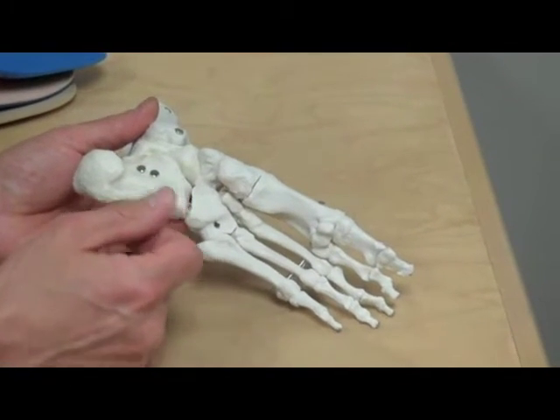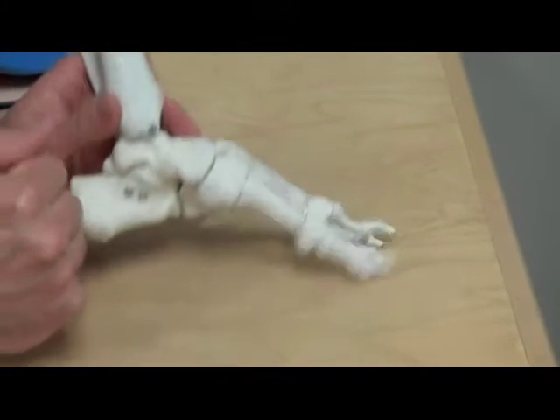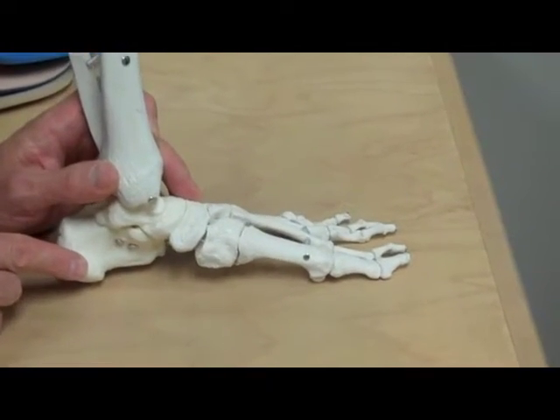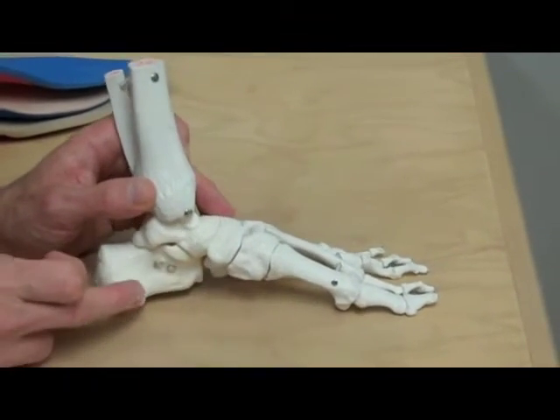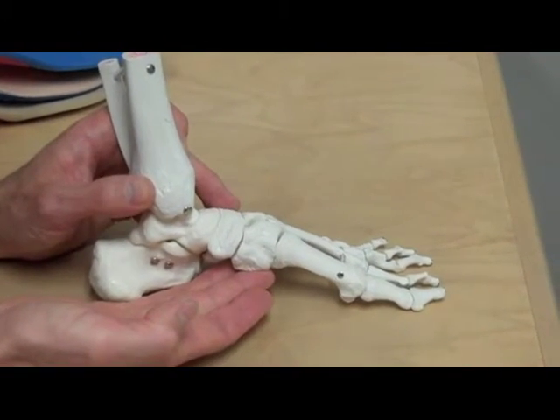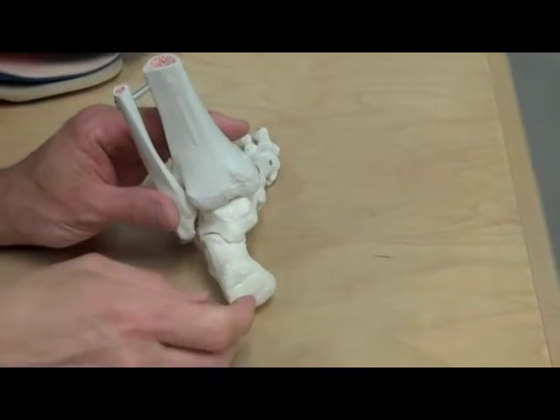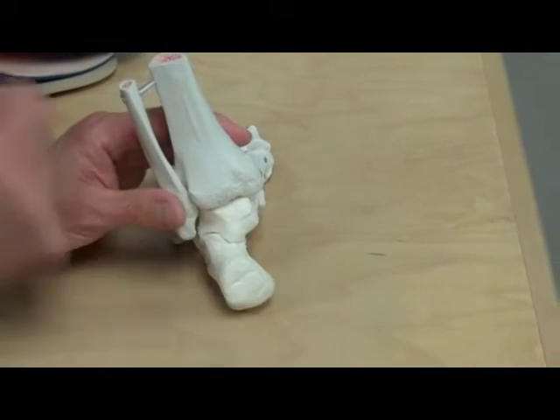But regardless of that, whether it's an itis or an osis, we still treat it the same way with orthotics. We're trying to take some of the strain off the fascia. So if you're walking and this is bowing down, you can see I'm stressing that fascia. Fascia is connected from here down to there. So I'm making it bow. So I need something that's going to hold it up over here. Okay, that's number one. Number two, from behind we can actually make a post to try to rotate that heel out to the side to, in a sense, do the same thing.